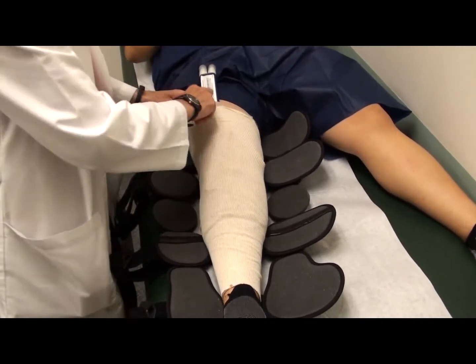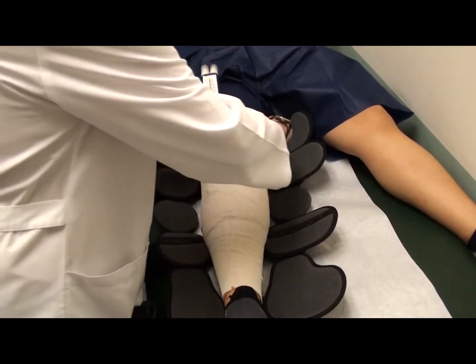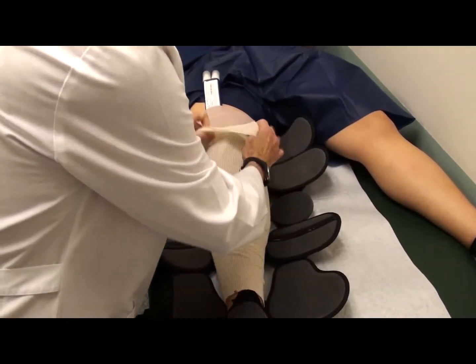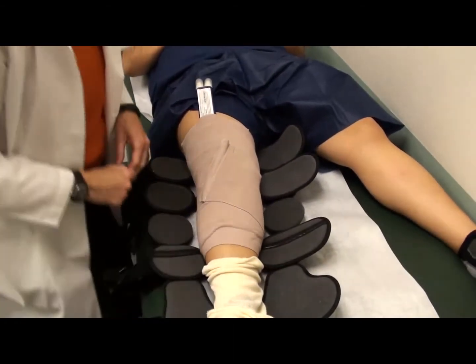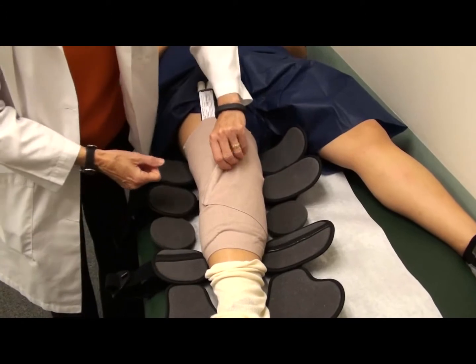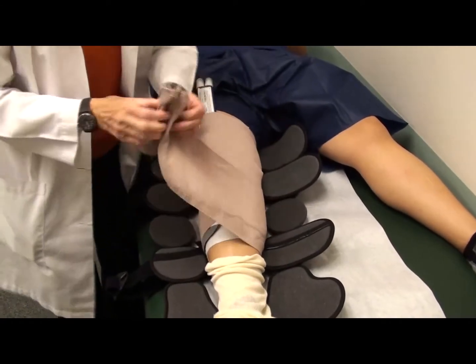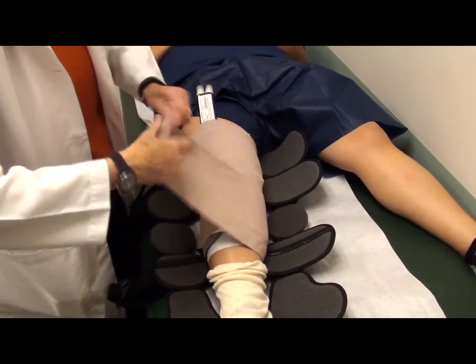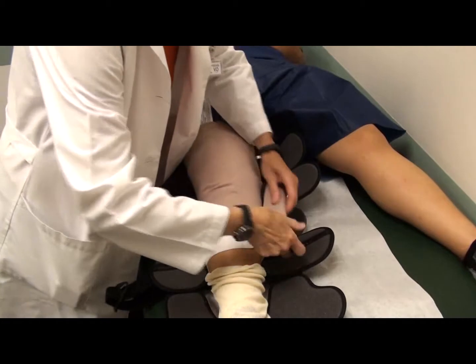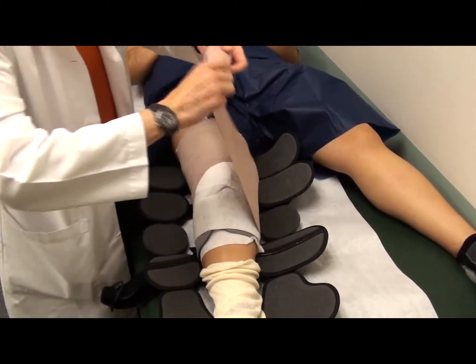The next step, I forgot to mention, you should wash your hands before you do this and then get them nice and dry. The next step is that you pull the stocking down. You don't have to take it off, but just pull it down far enough that you can see the dressing. So the next step is to take off the Ace bandage, and you may want to roll it up as you take it off, because that way it's a lot easier to put on. You'll be replacing this later.